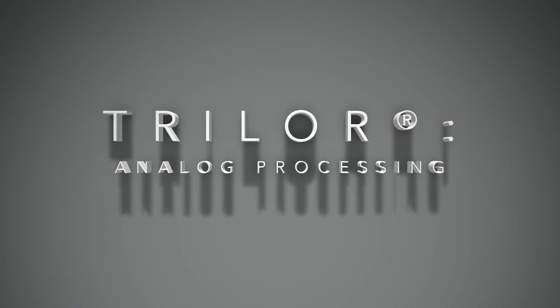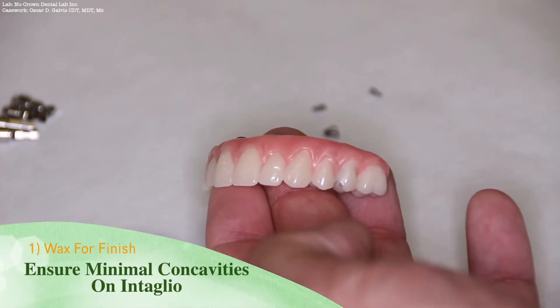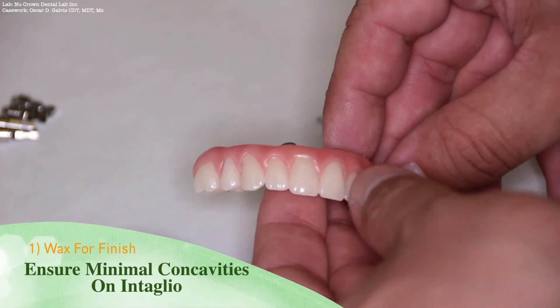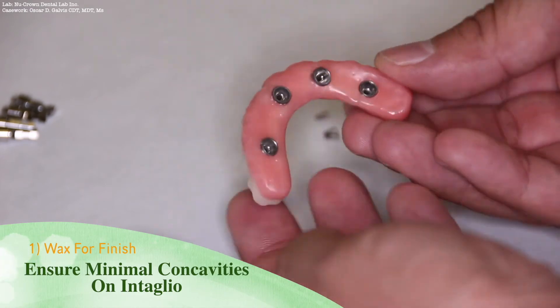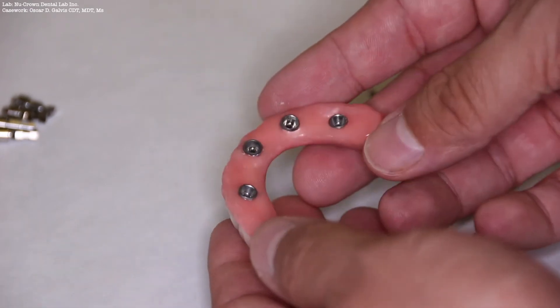Trilor — the analog processing procedures. At this stage of the process, the waxed try-in has been approved and the arch has been finally waxed. This arch has a Trilor substructure within it and it is ready to be processed.